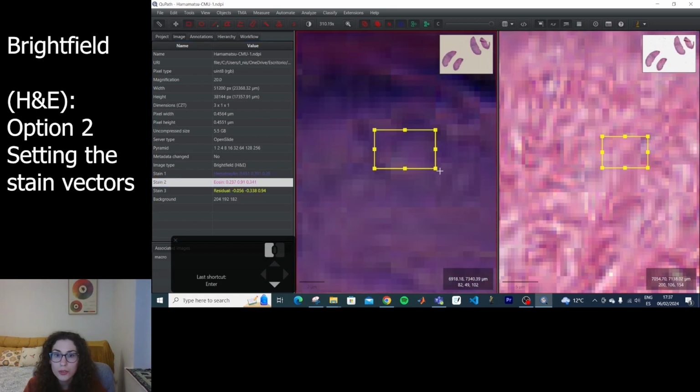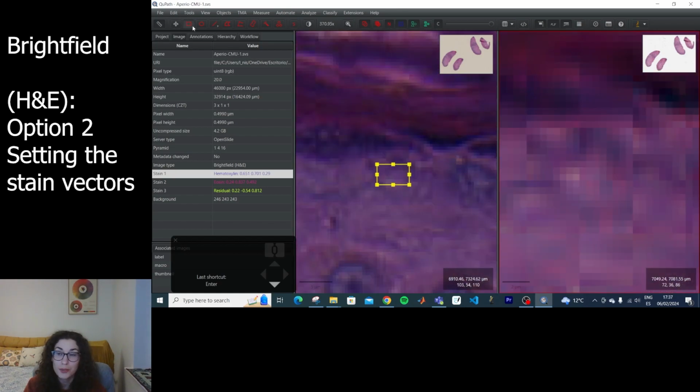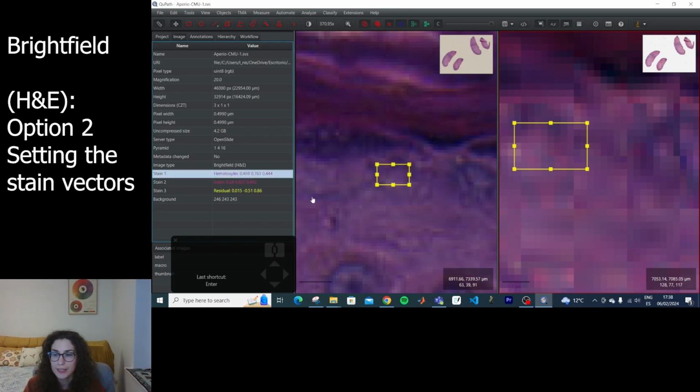Let's do this here. Where are we here? Where am I? Yeah, they look so different. The colors are so different. Okay, and this one is for pink compared to this purple one. That is the same. Okay, cool. And it has automatically updated the residual thing.